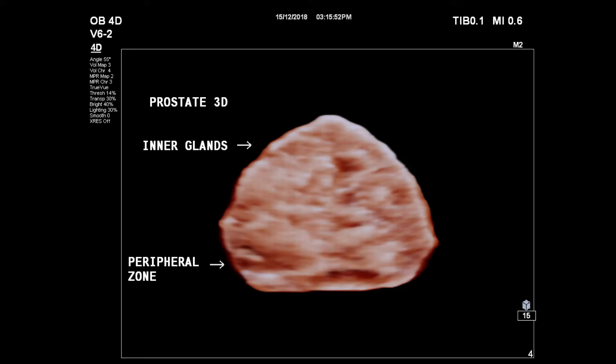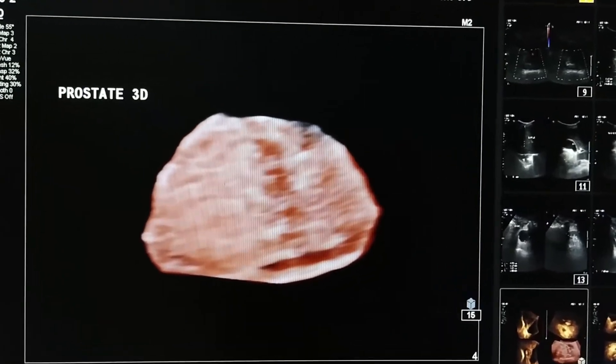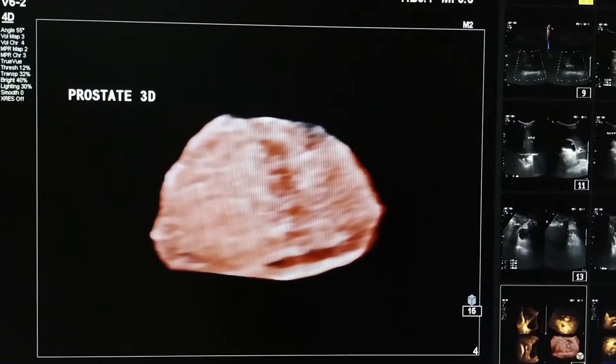Hi everyone, let's see how the prostate gland looks in 3D ultrasound. This is a 3D view of the prostate gland.